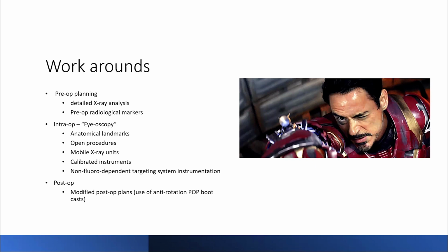So if you were doing a SCFE, for example, or if you are attempting to do a guided growth for an open physis, you place your K-wires, have the mobile X-ray brought in, take your X-rays intraop and wait for the films to be developed. And then you see which of the wires is where you want it to be. The problem with that is it causes an unnecessary prolongation of surgery.